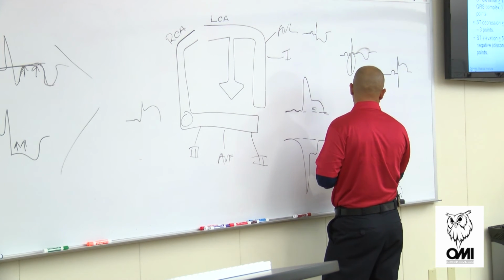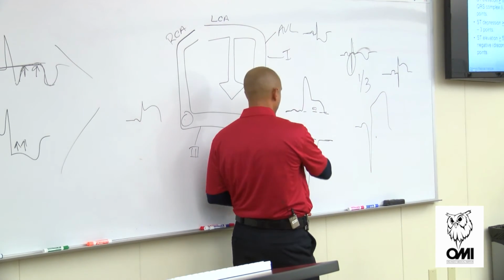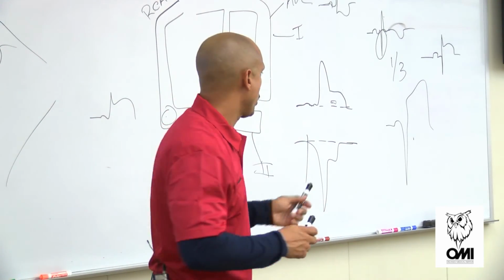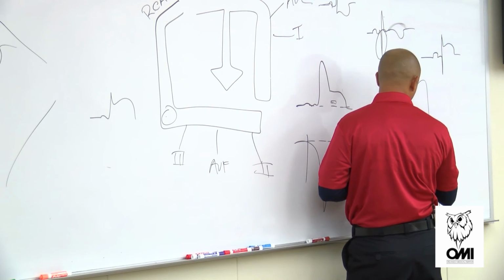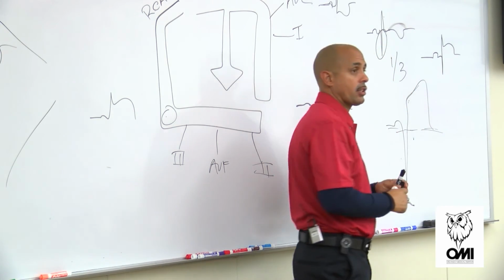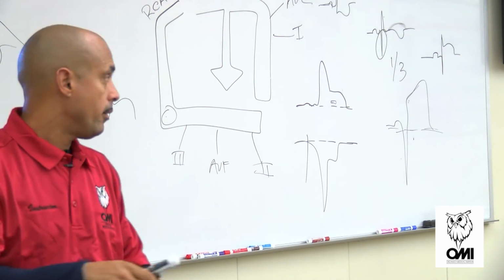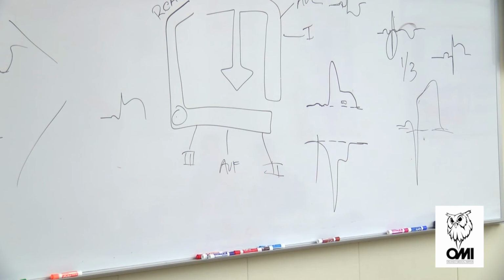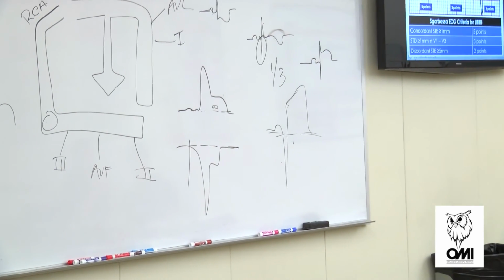That one going down is representing the left bundle? Yes, it could be, or a ventricular pacer. There's a spike there in a wide QRS. It could be the same thing. See this discordant? So where's my QRS at? Predominantly on the bottom, and my ST segment is on top. So we're on opposite sides of the isoelectric line. That's discordant. If that's 5 boxes or more, that's a STEMI. So the first one is concordant, second one's concordant, and the last one is discordant.